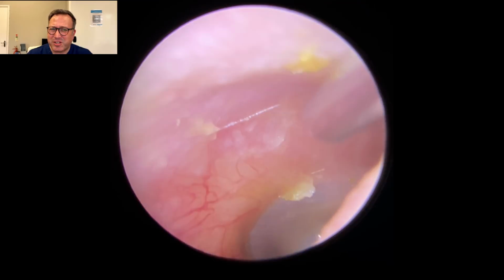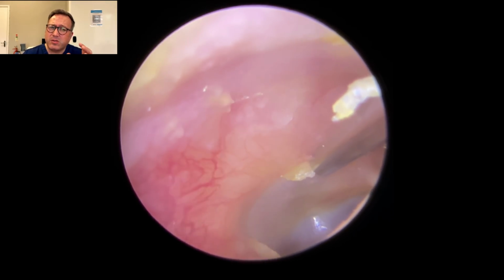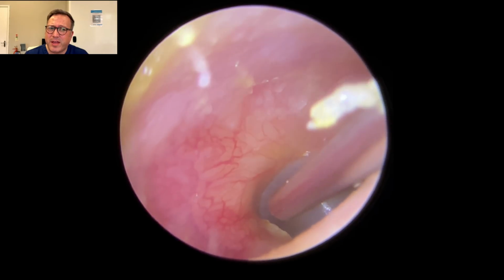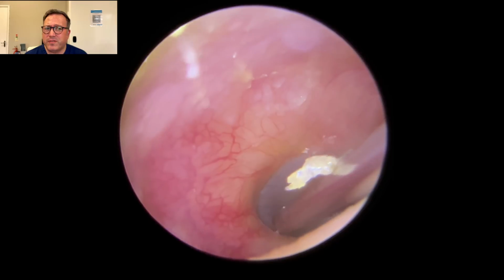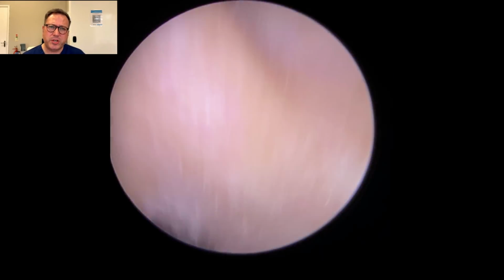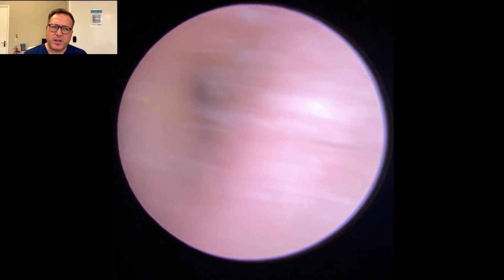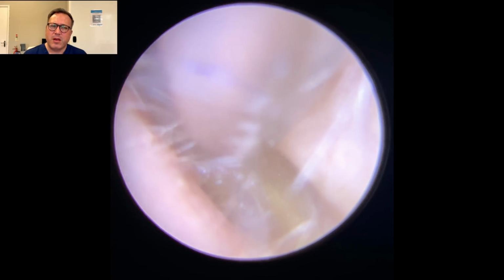You can see actually with this canal, look at all the blood vessels, how they come to the surface. So this is quite an aggravated ear canal. You can see there's a little bit of redness there. And very gentle to take that piece away. You wouldn't necessarily need to remove these pieces. I'm just doing it for the sake of completeness here. But it's all very much dependent on how your patient is coping with the procedure. Some patients do struggle a little bit sometimes with the procedure, but most of the time people are pretty good. As long as your patient is happy enough for you to continue, I'll carry on and get the rest out.